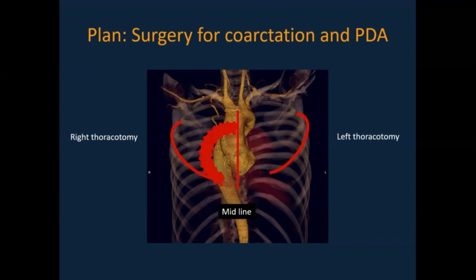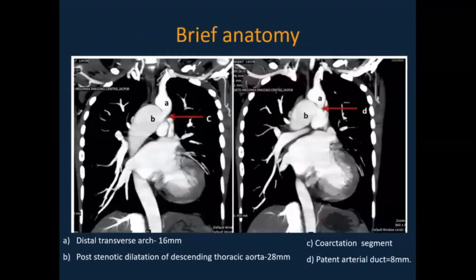And this patient was lost to follow-up for 6 to 8 months and roamed around a lot of places. Again, he came back for an intervention option. So this was the coronal plane. Now this is the ascending aorta. You can see in this cut, there's a severe coarctation of the aorta, and there is a large PDA at the junction of the coarctation as well.